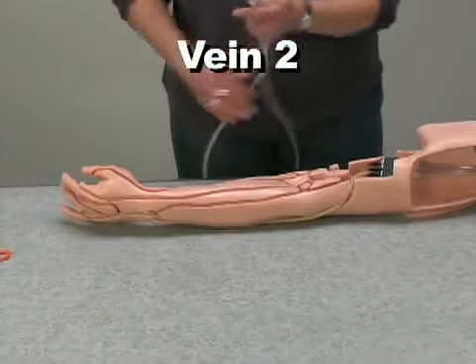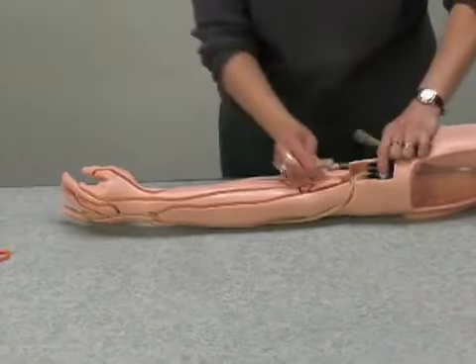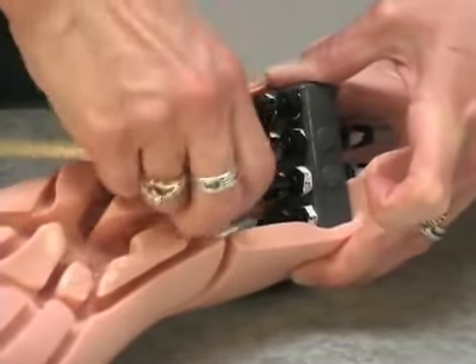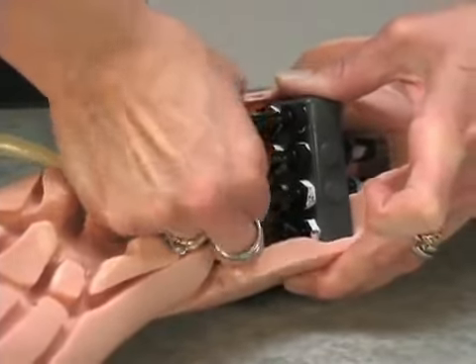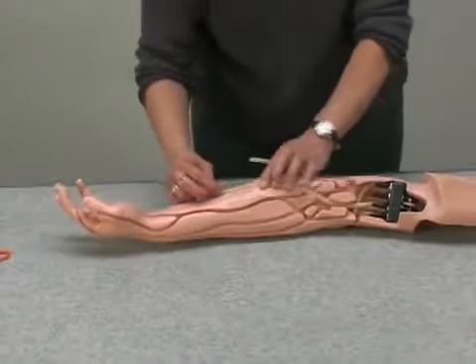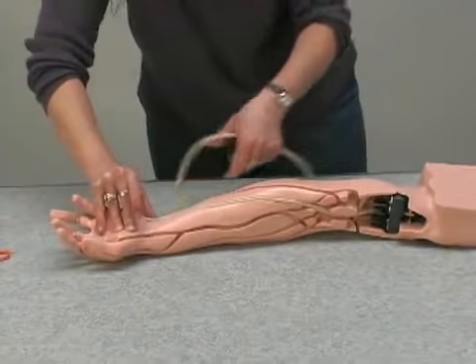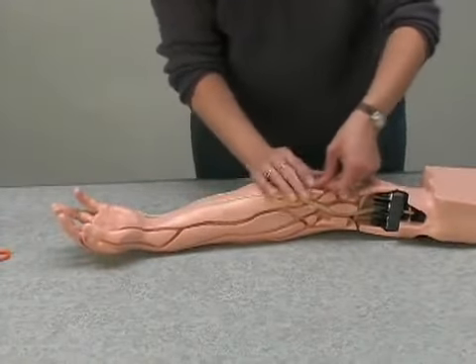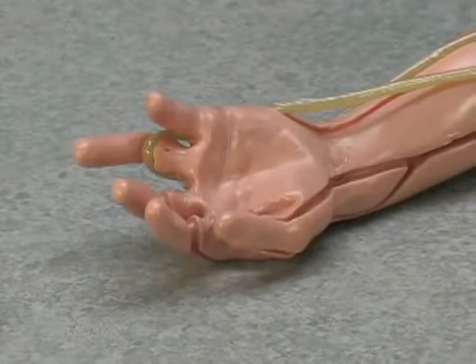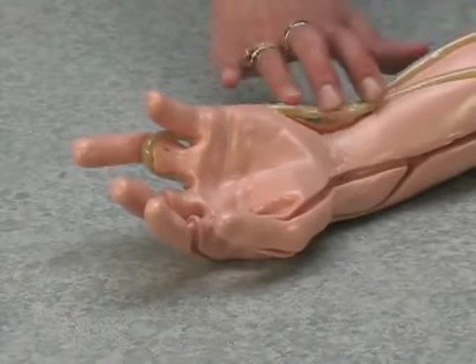Take the second vein, lubricate, and connect to fitting number 2. Press the tubing into the channel, around the loop near the wrist, and back to the connector block. The tubing may be loose around the wrist. It easily slides back into the channel and will not be a problem for installing the replacement skin.